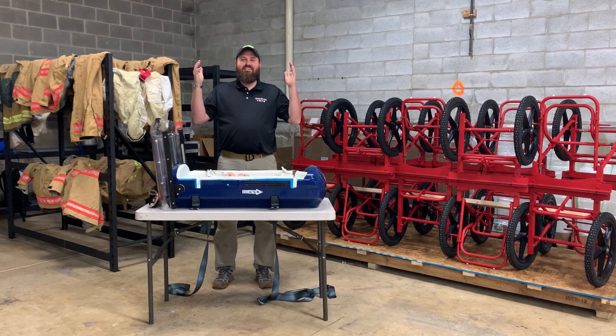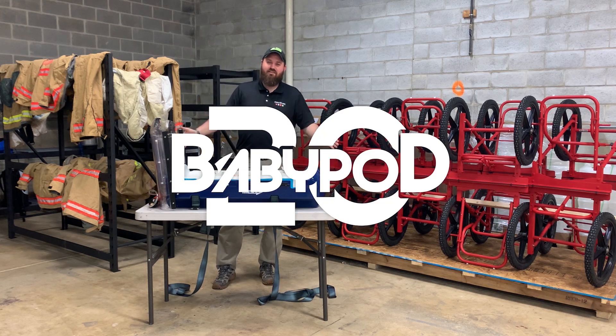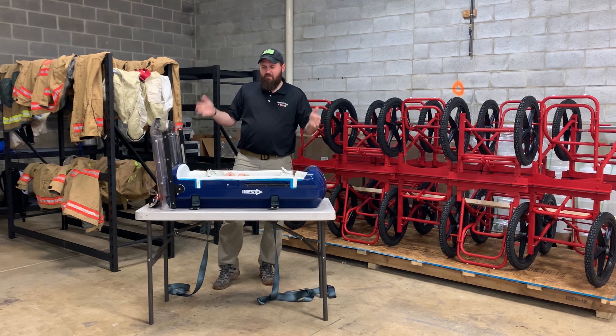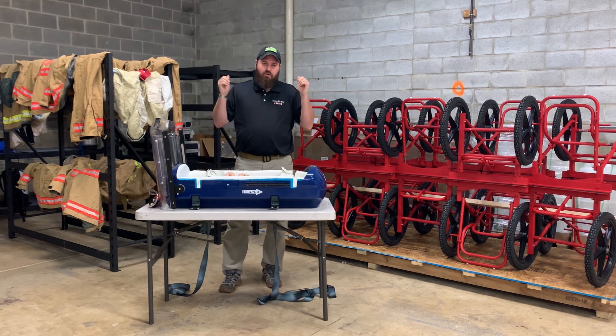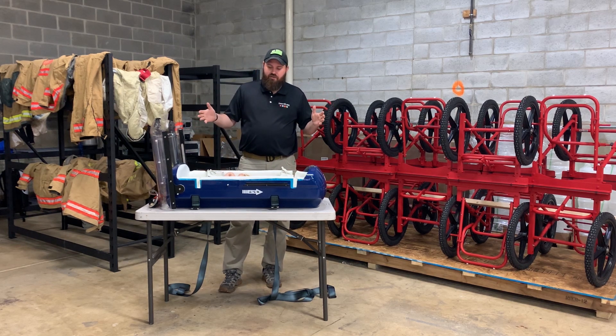Hey, it's Cory from Firstline, and today we're going to talk about the BabyPod 20. The BabyPod 20 is an infant transport device that will work across all modes of medical transport.